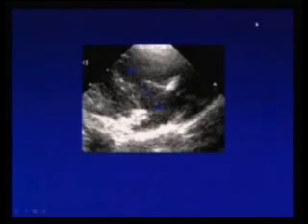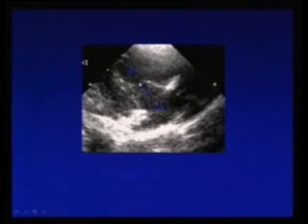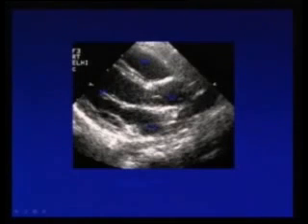This is echocardiography of the same. This is the parasternal long axis view, most posterior plane. So the right ventricle inflow you are getting here. This is RA, tricuspid valve, and the right ventricle. This is the proper long axis view which you see: left atrium, LV, aorta, RV.